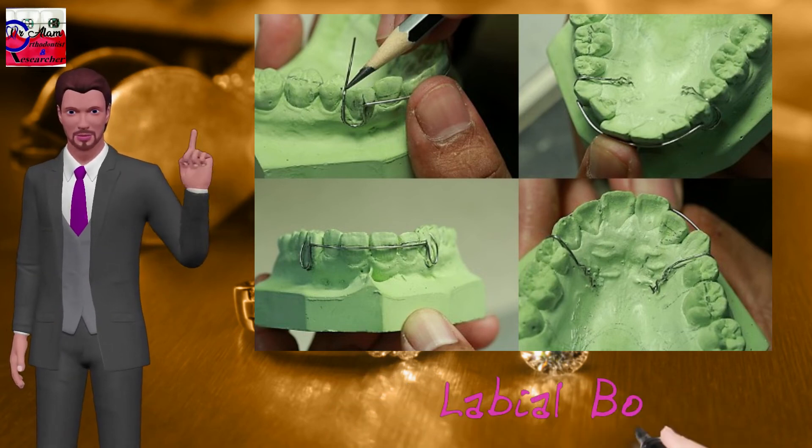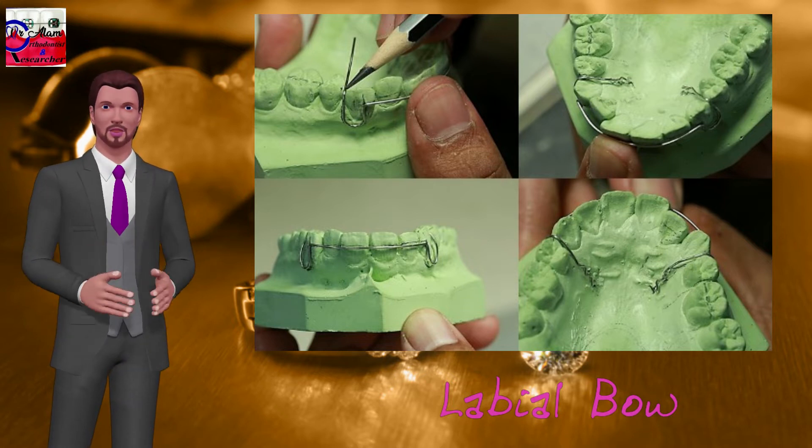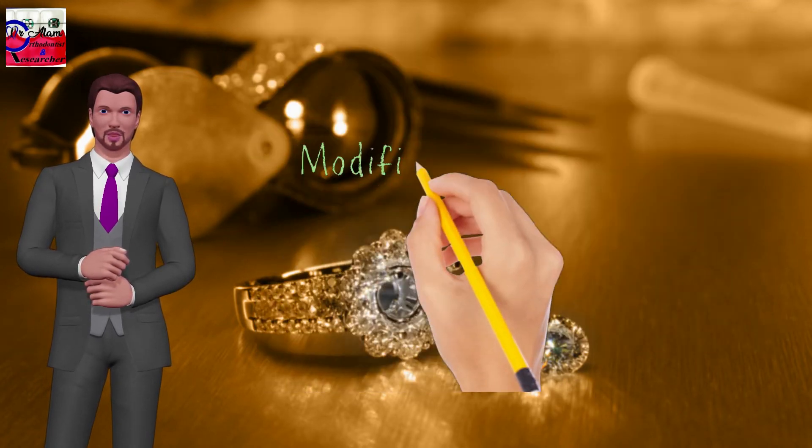Labial bow is made of 0.7 mm stainless steel wire. It is used for retraction of anterior teeth and retention of teeth after active orthodontic treatment is completed. The following are the modifications of the labial bow.